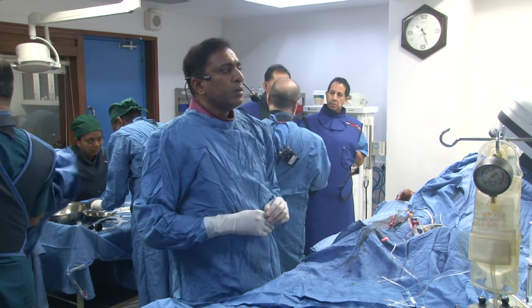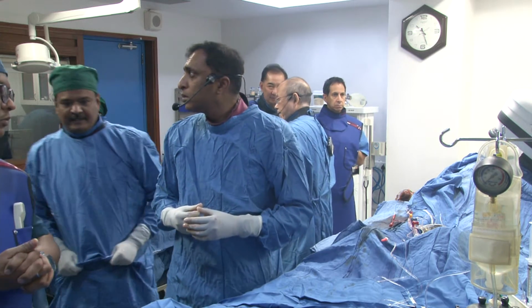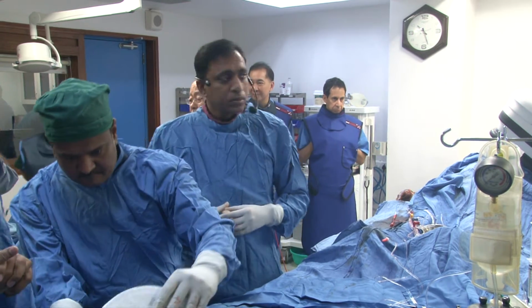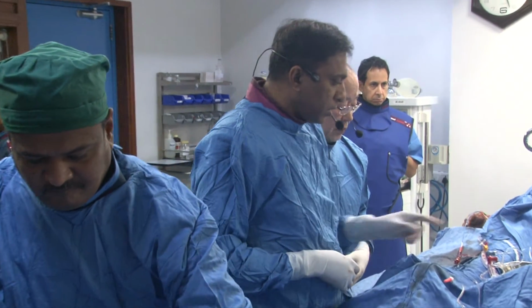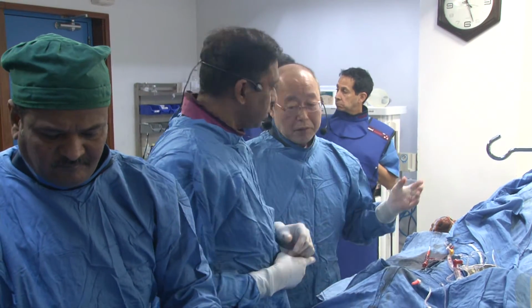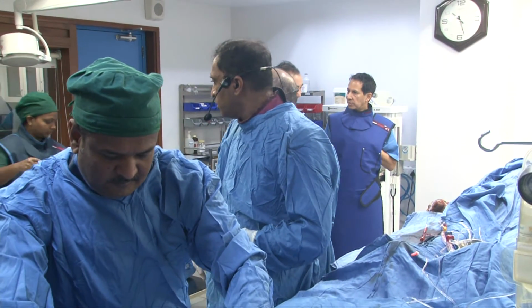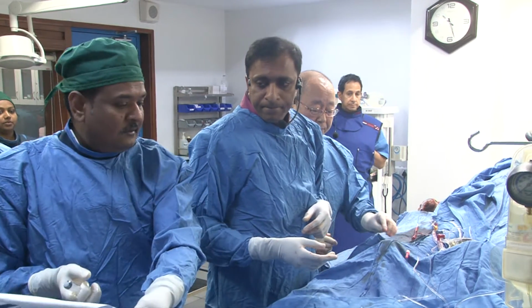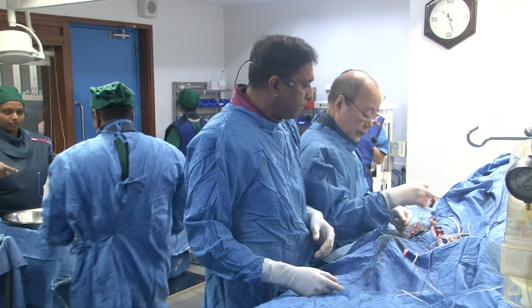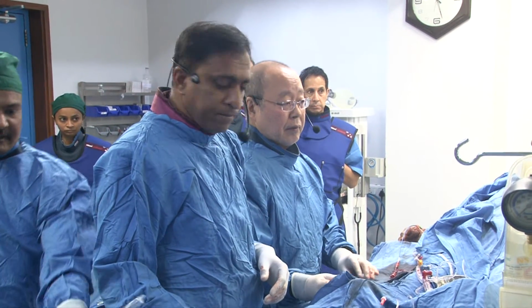IVUS is not good for that. Do you use some nitro? They asked regarding whether we can use nitro. Nitro? Yeah, please, if you want to use, yes.